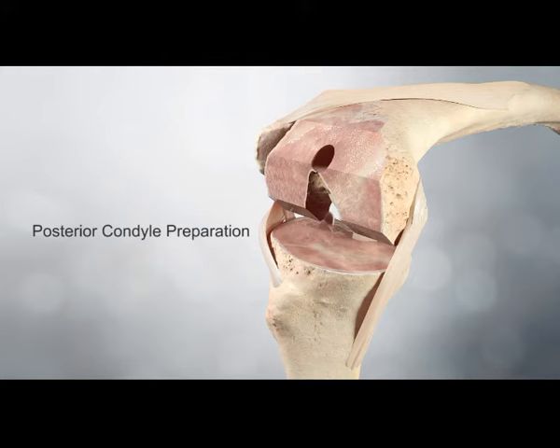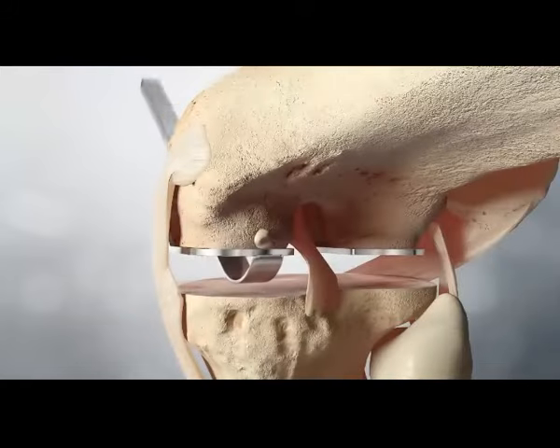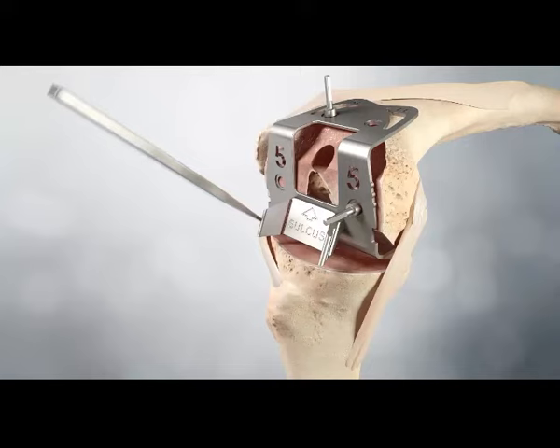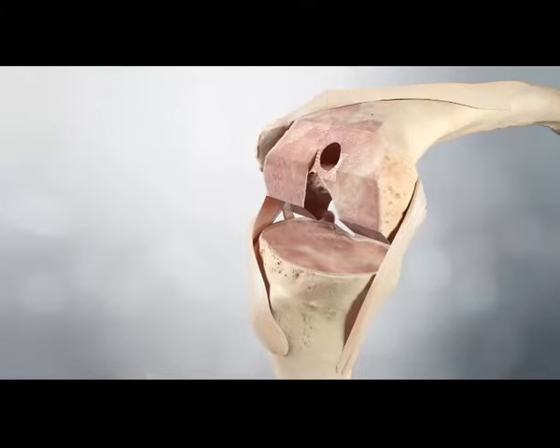Posterior condyle preparation. For a CR procedure, the femoral finishing guide that corresponds to the femoral size is positioned. Any excess bone or residual osteophytes in the posterior recesses are removed using a curved osteotome or gouge. The sulcus cut is performed using the sulcus cut ramp. The femoral finishing guide is removed.